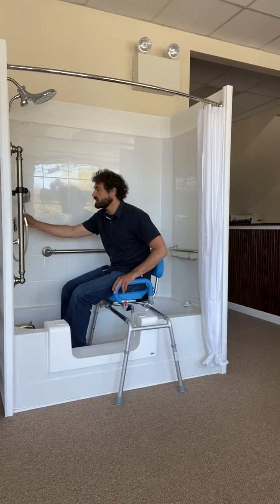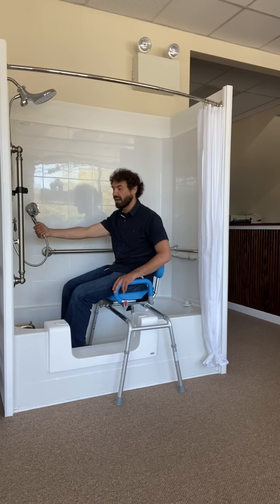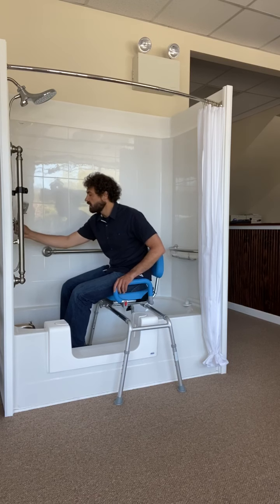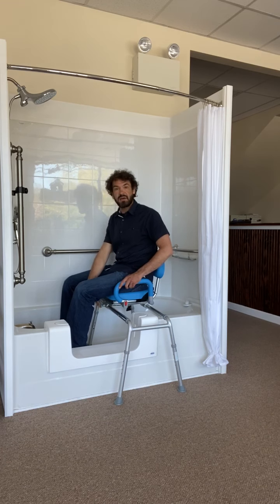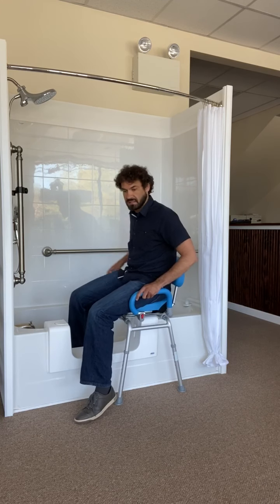Of course we always have the mobile shower head mounted right here, so the individual can grab it right in front of them and then take care of business. Once the bathing experience is complete, we're going to once again press down on this button under the seat, and that's going to release the seat.